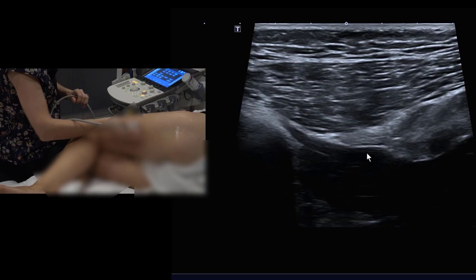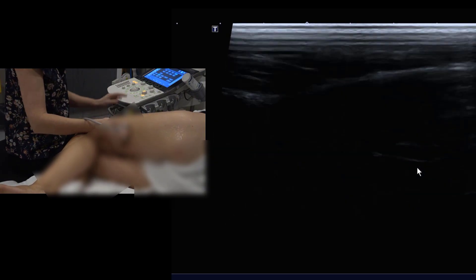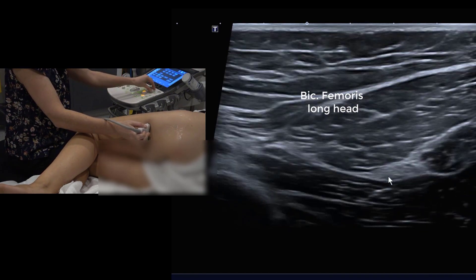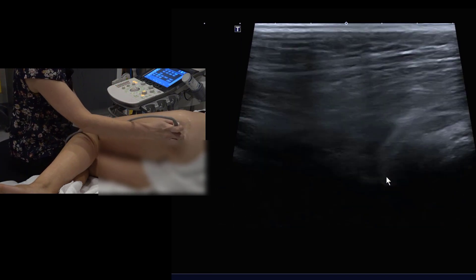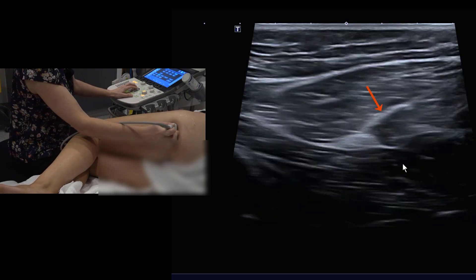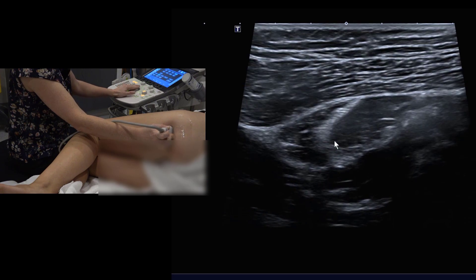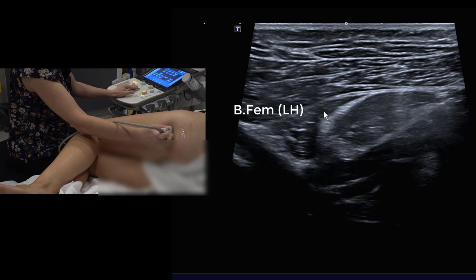For sciatic nerve excursion, the sciatic nerve is easy to find in transverse by running up the posterior thigh — it sits quite laterally underneath the biceps femoris. In the upper thigh there's a nice echogenic line representing the conjoint tendon. Running distally, the conjoint tendon forms a small echogenic vertical line where semitendinosus merges with biceps femoris.